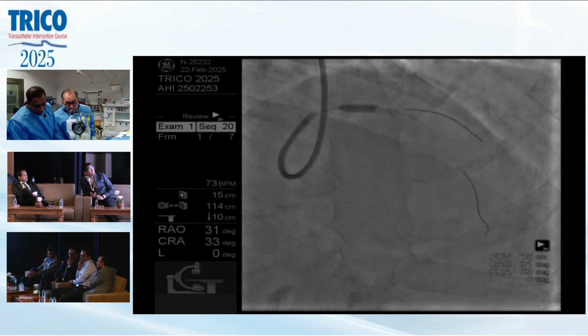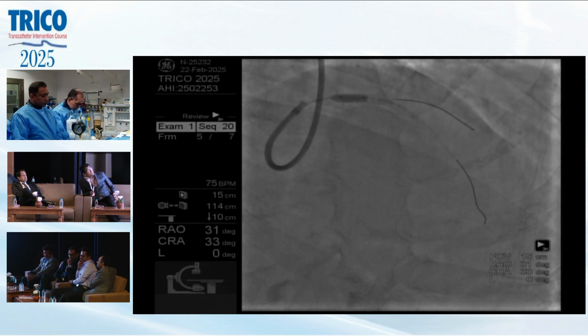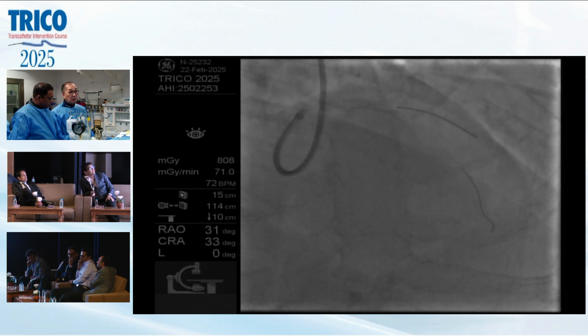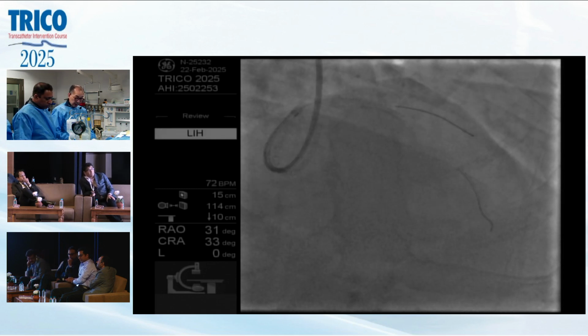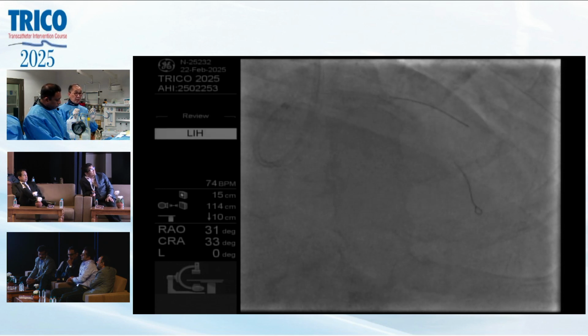Domestic? Okay. So it looks like the shoulder is not that bad. Some balloons, the shoulder, the dot is really not the same as other balloons. The edge can really create a problem. And this brand of balloon, I don't have experience with, but it looks okay. The best POT balloon actually is from China. There's a balloon called a POT balloon, okay? And the dot is really at the edge of the balloon, a short 6 millimeter balloon, and it's excellent for POT. Okay, let's take a picture.